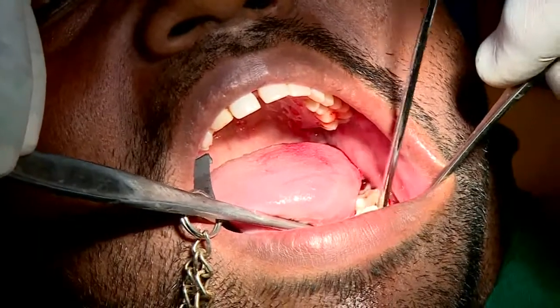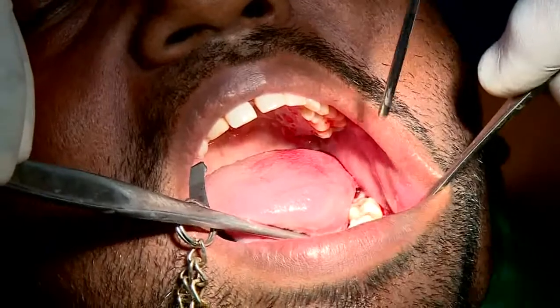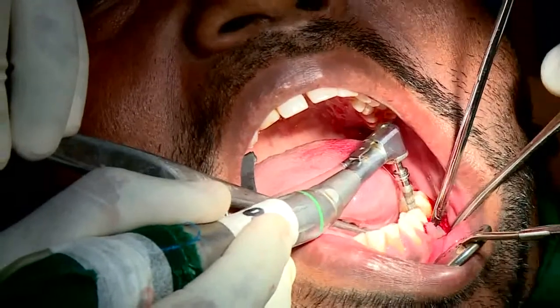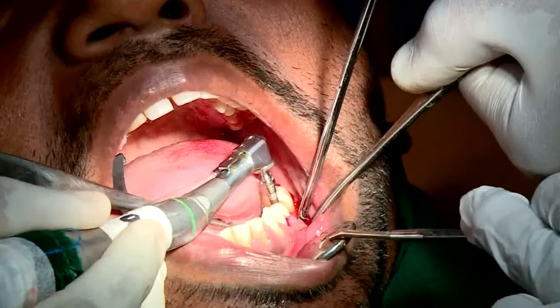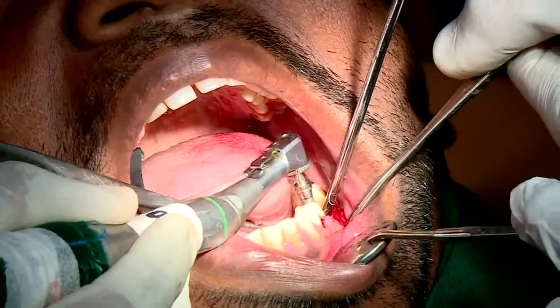So you have to make it absolutely right. Another thing I would like to tell you is the placement of the implant. Now, in this case, sir is placing it in the 3-6 region. Even though he has placed it equidistant between the premolar and molar, these are the basic guidelines.